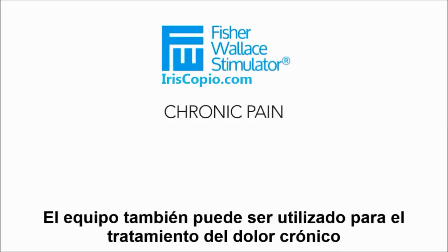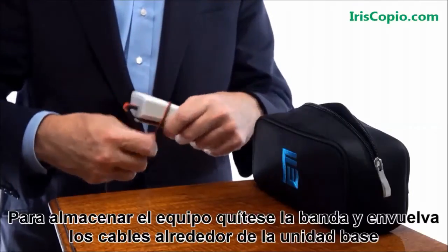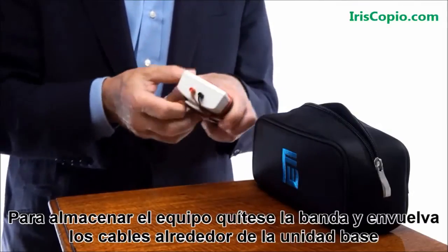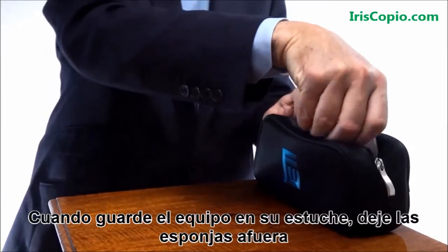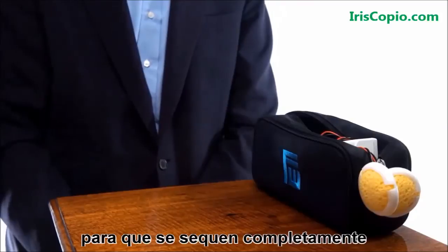The device may also be used on the body to treat chronic pain, including neuropathy, arthritis, back pain, and other forms of chronic and acute pain. To store the device, take off the headband and wrap the headset around the base unit. When storing the device in its case, leave the sponges on the outside of the bag so they can dry thoroughly.